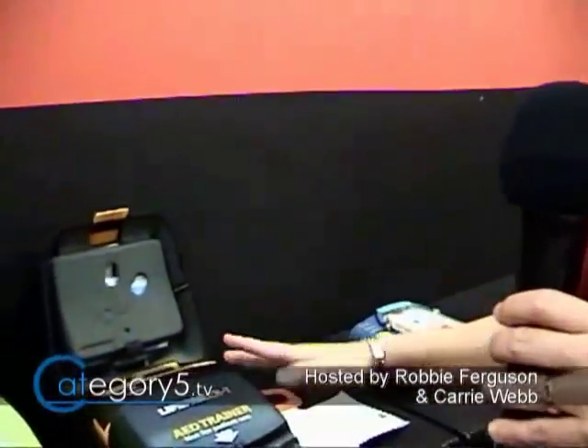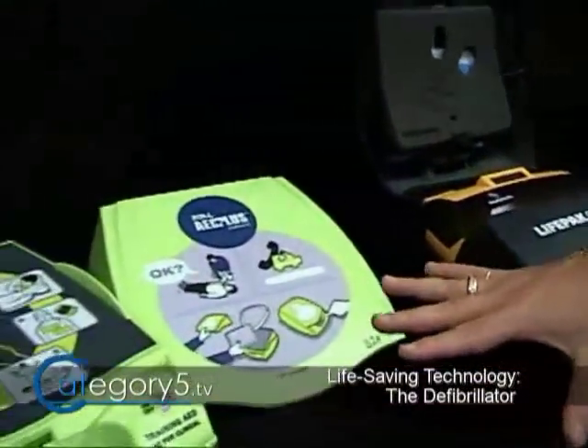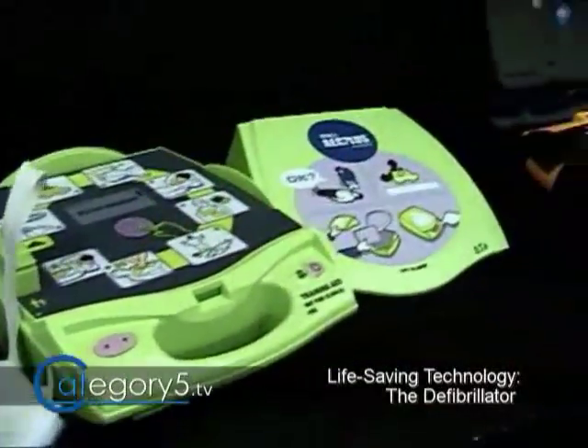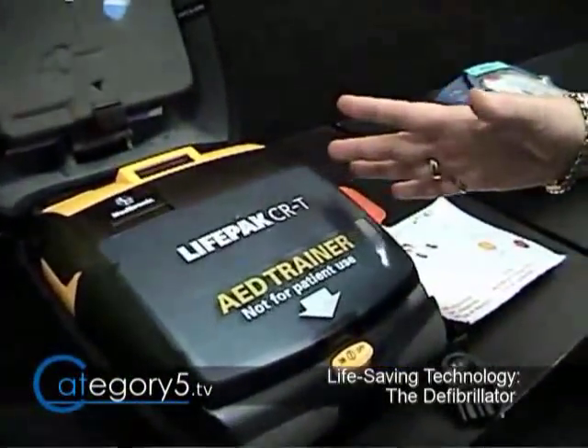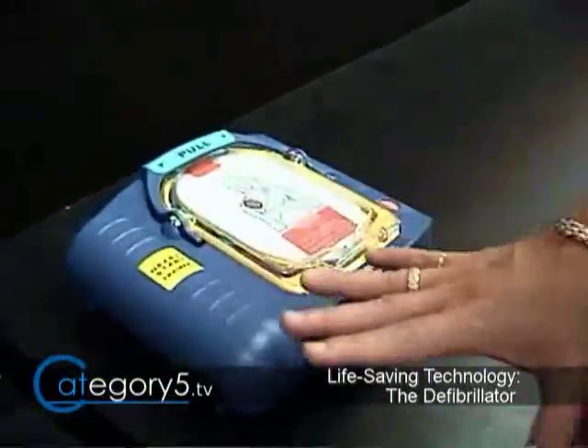Here are some examples of different kinds of machines you might come across. All the machines do the same thing — they are all shock boxes. Whether it's a green one with lots of pictures, or one that turns on by itself when you push the button, or the one we just practiced with, they all do exactly the same thing.